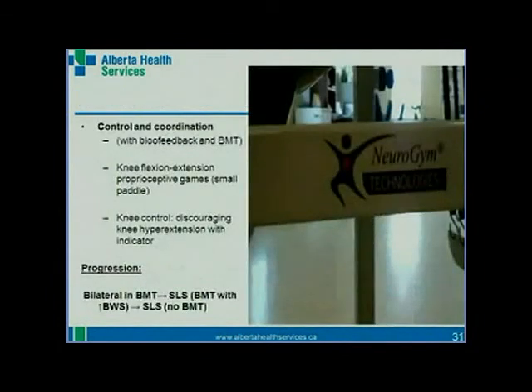Control and coordination. One of the things that I told you about my client at the beginning, and often your client will be similar, is the knee hyperextension. So I use the goniometer biofeedback system in order to work on a proprioception of the knee, and especially at the very little range of extension, close to hyperextension. And I will put something, you can adjust it so when it goes in hyperextension, it beeps and the game stops. So it's good to retrain the client not to go in hyperextension.